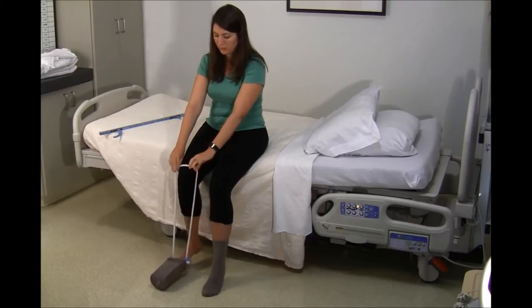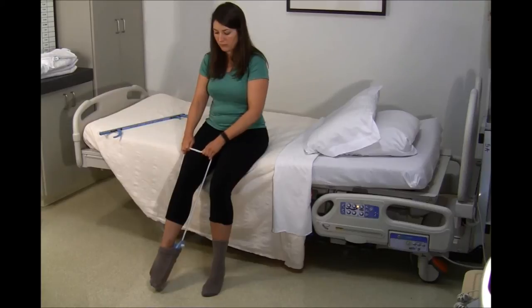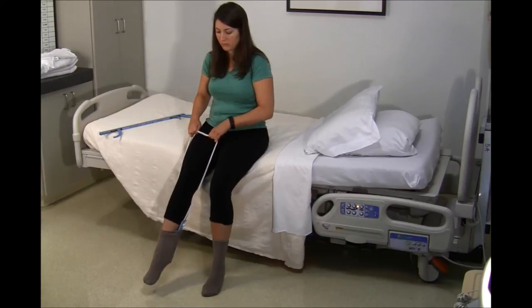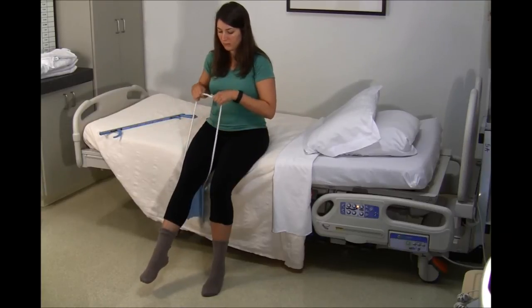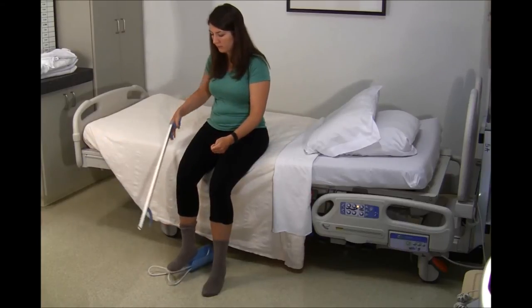Notice how Caroline is maintaining her hip precautions by not bending too far forward. Her hands do not go below her knees. She does not lift her knee too high when pulling the sock on or removing the stocking aid from the floor when she's finished.